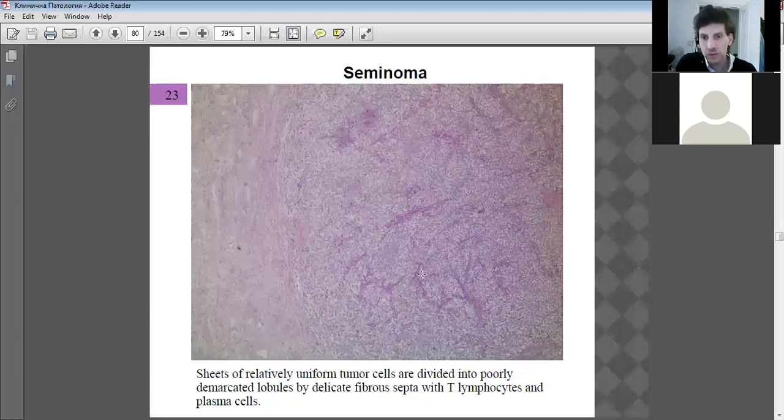These lobules are separated by the darker purple stained areas, fairly haphazard in the mass. Fibrous septi, fiber is going to also form in between the lobules, so this dark tissue is the fiber. Some areas of necrosis, blackened areas I can see there towards the center, it's necrotic tissue.